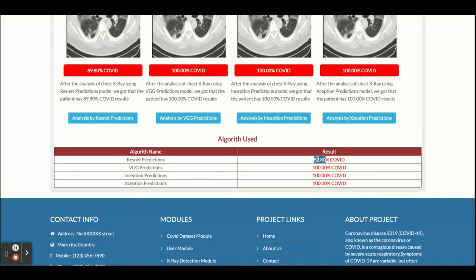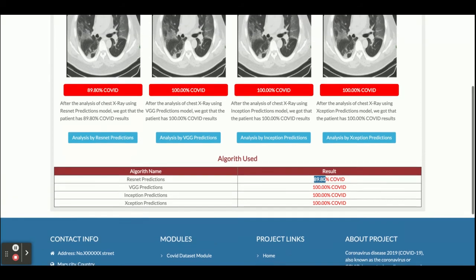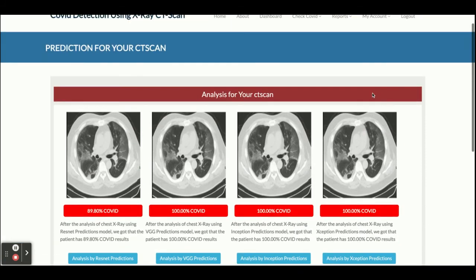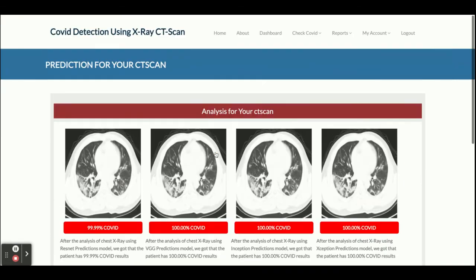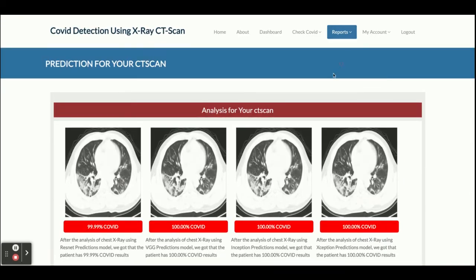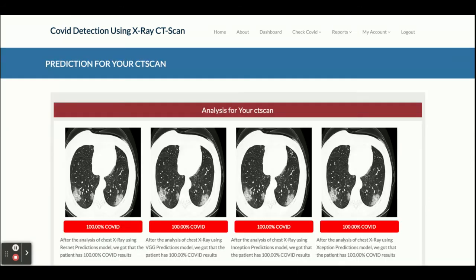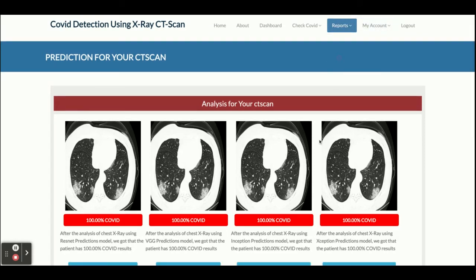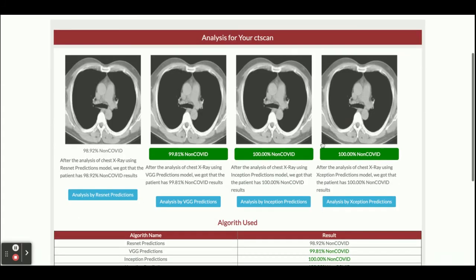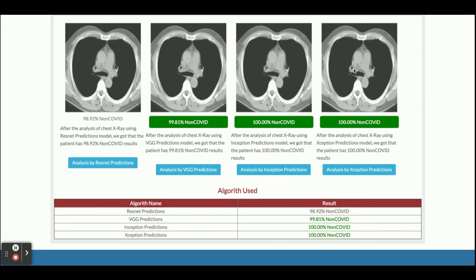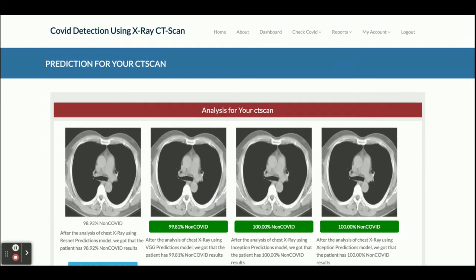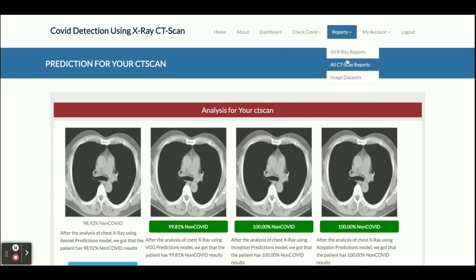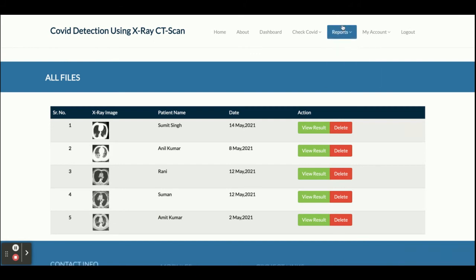Now I can see all of the CT scan reports here. I'm checking a third CT scan — this one belongs to a healthy, non-COVID patient. The result says you are not a COVID patient, meaning after analyzing the CT scan the system is saying you don't have COVID symptoms. This is the all CT scan reports section.